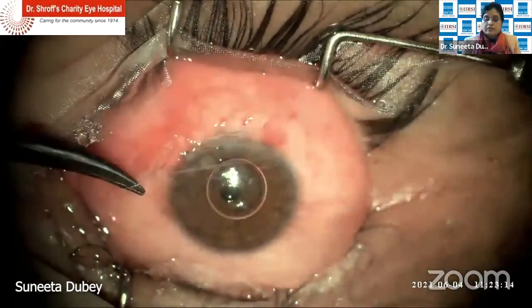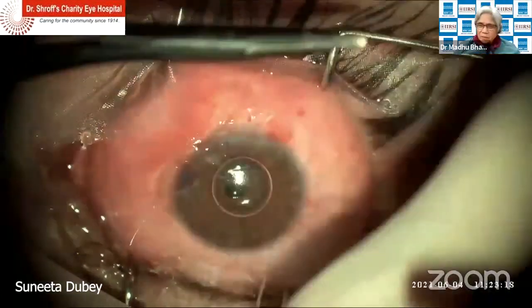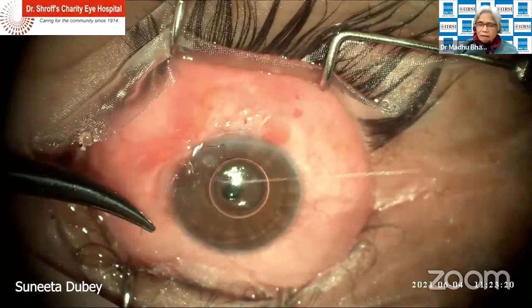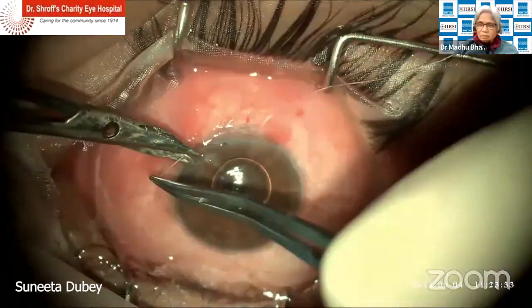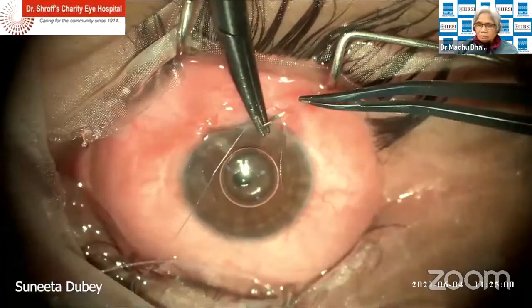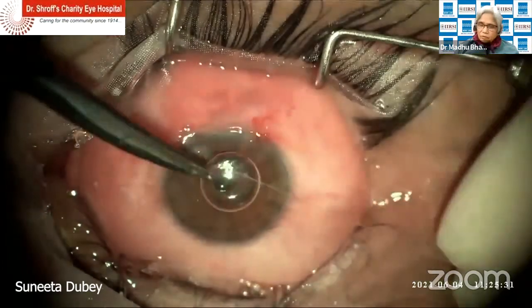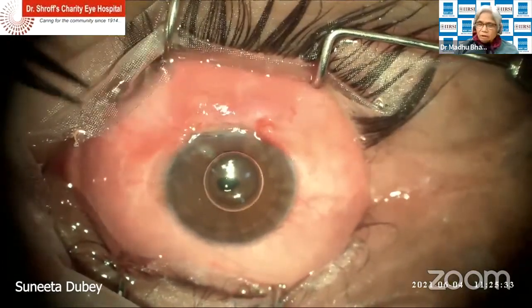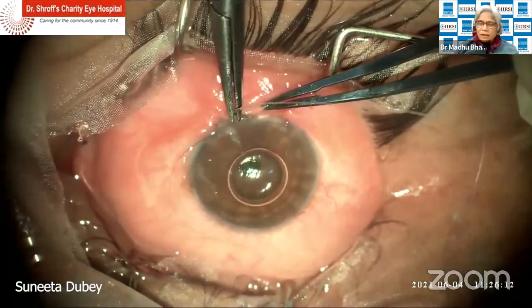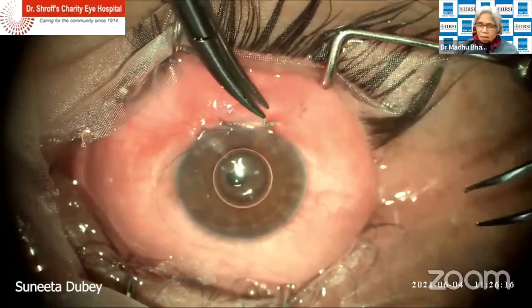Any other opinions on this? She said very rightly, it should be sweating from the edges. Basically, it looks like a sweat, a very fine, thin film that comes slowly, gently. That's what we look at. And that should come. If that doesn't come at the time on the table, it doesn't come afterwards also. So on the very first morning, releasing releasables is not a great situation to be in. So it should be a little bit of a leaky wound, but not really.